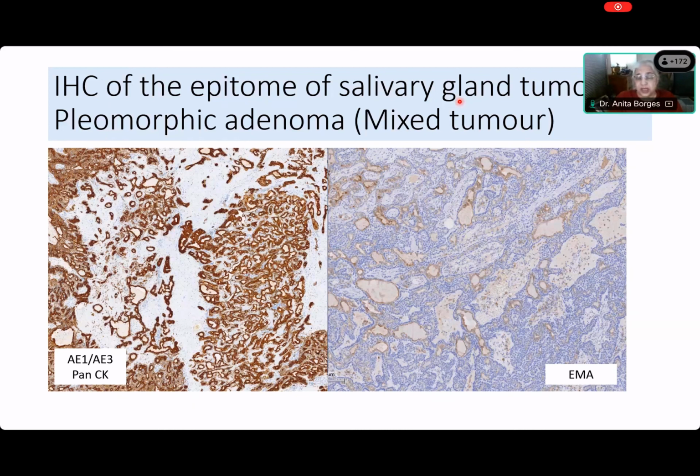Yes. So can you see these? These look like lumina, but they are not lumina, for the simple reason that you can see stromal cells sitting inside of these. And that's why I was so keen that you notice that you see true lumina and you see false lumina. And these are false lumina because you can see stromal cells sitting inside of that.